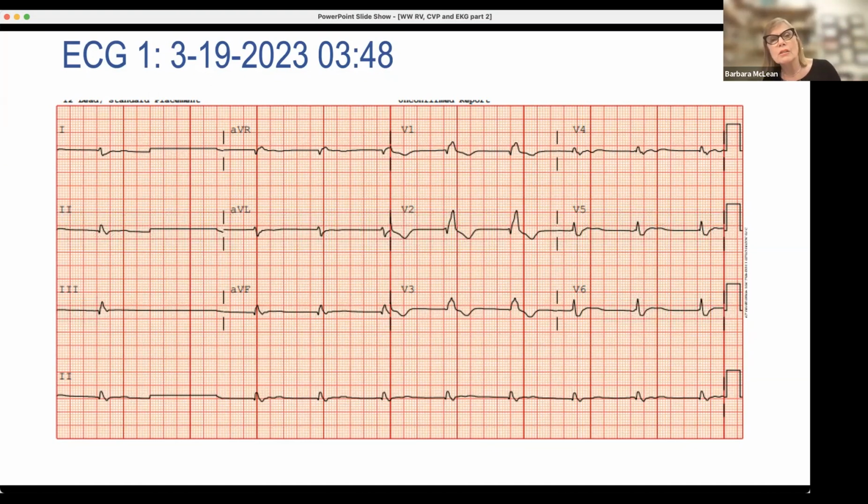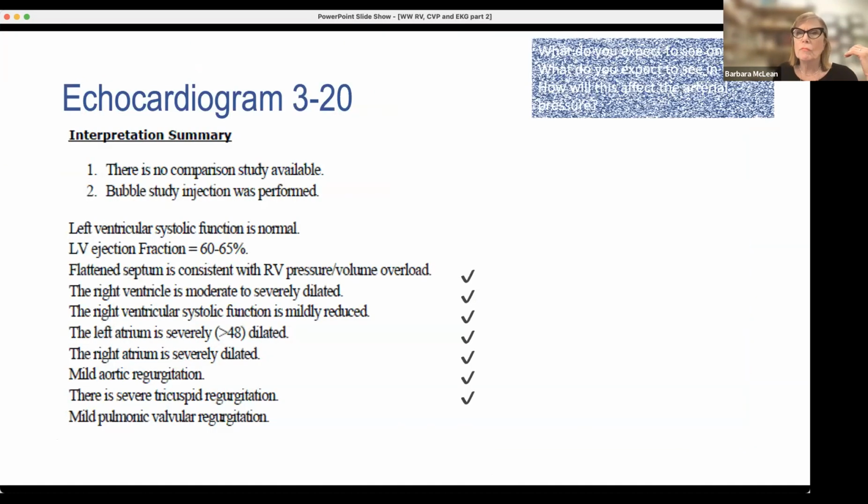So I'm a little bit hesitant. She hasn't gone to the cath lab. I don't know what her disease state is. She's a chronic renal failure patient. She has a lot of electrolyte imbalancing. Probably for me, I would just say, yeah, I want to pace her around 60. If she has an accelerated idioventricular rhythm, which is almost where she is now, she'll overdrive that pacemaker. I'm just going to set the pacemaker up in case she has prolongation and an asystolic event.